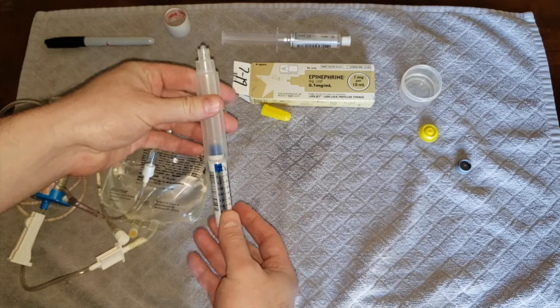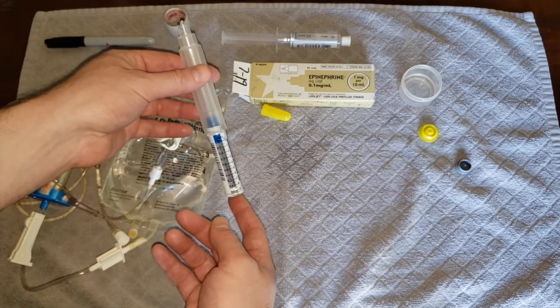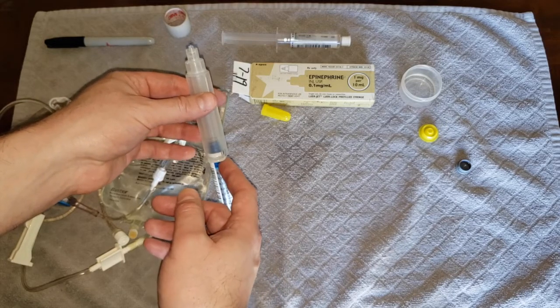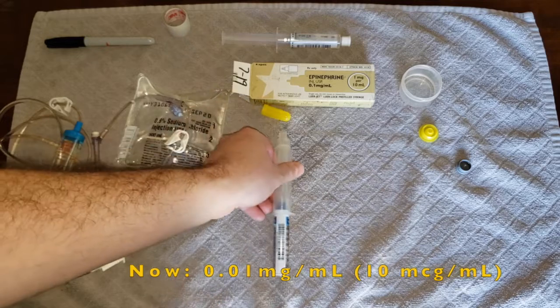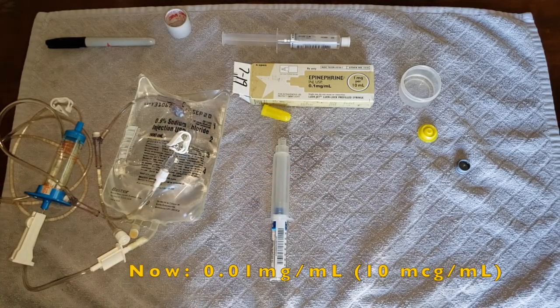At this point, we have a 10 milliliter syringe with one milliliter of epinephrine — or 0.1 milligrams — mixed into nine milliliters of saline. This gives us a new dilution of 0.01 milligrams per milliliter, or 10 micrograms per milliliter.